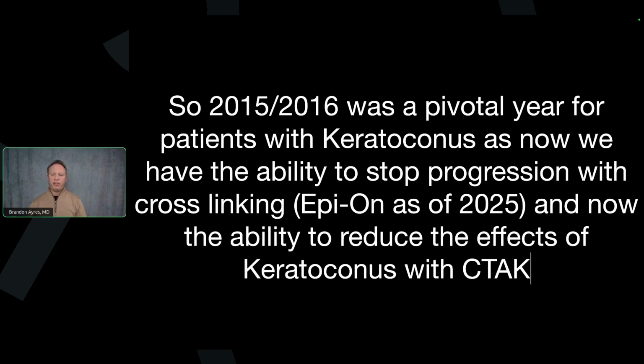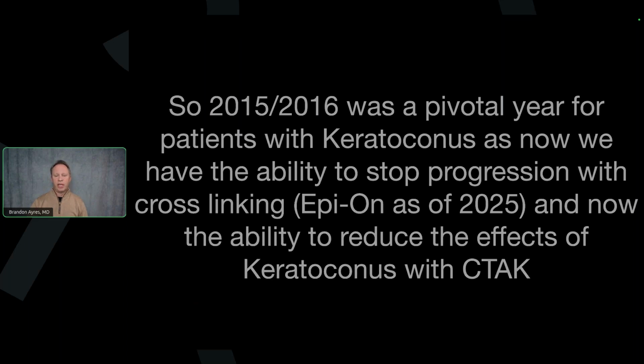So 2015, I think, was really a pivotal year. We were now not only able to stabilize the cornea, but also start the process, or the idea, of CTAK, which has now really moved into almost full swing. And maybe we'll be able to continue this with the approval of epithelium-on collagen cross-linking. I think it's almost impossible to talk about keratoconus and not integrate collagen cross-linking, diagnostic testing with the Pentacam, and CTAK. They are three great flavors that all go together.